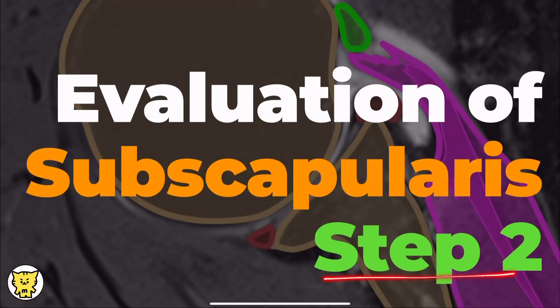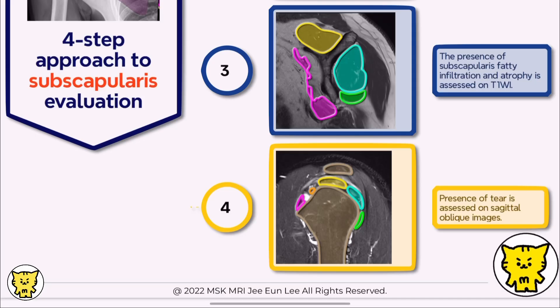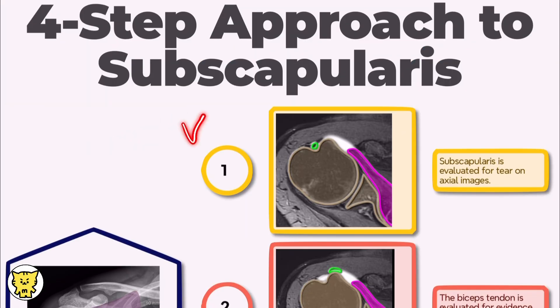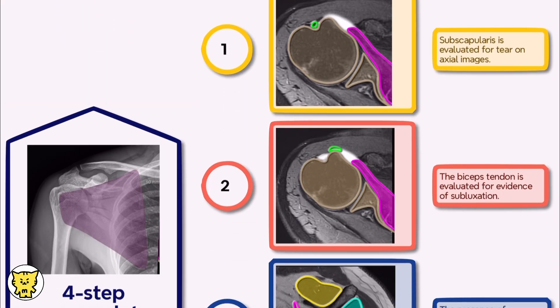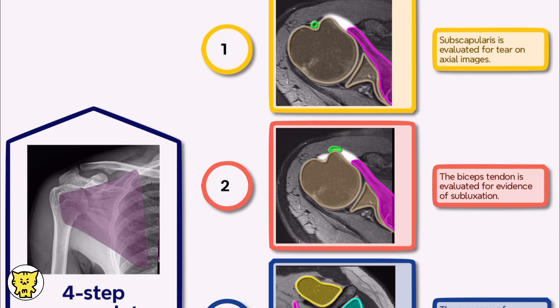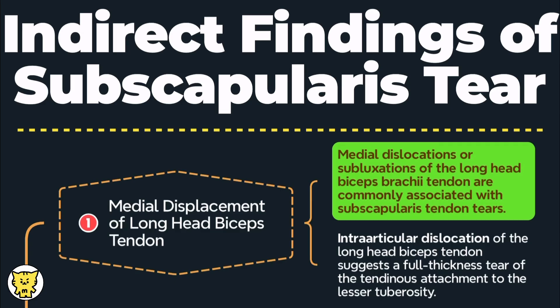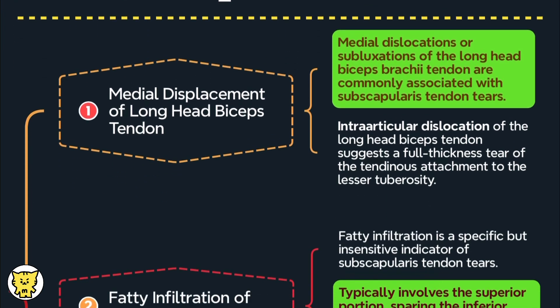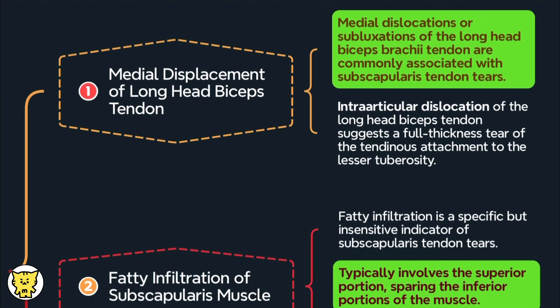Today we're diving into our second session about how to spot subscapularis tears when looking at axial images. On axial images, medial displacement of the long head of the biceps tendon is most commonly associated with subscapularis tendon tears.